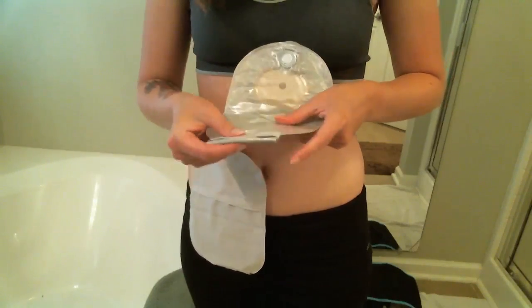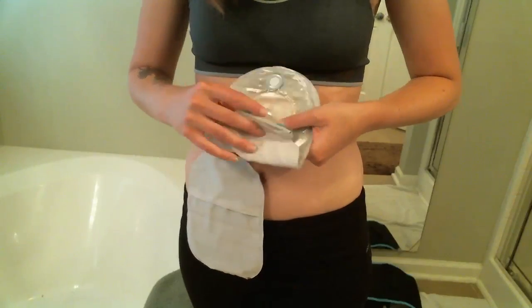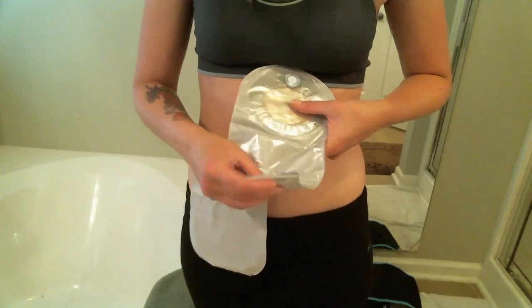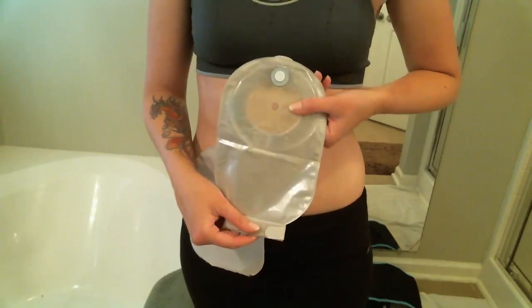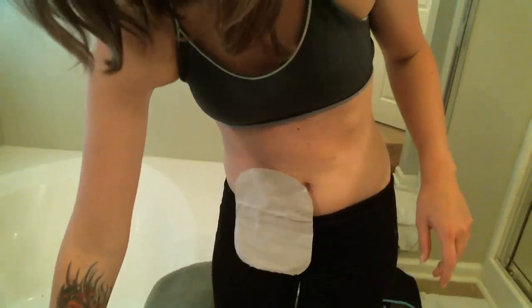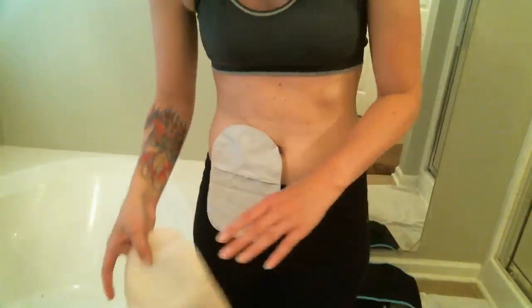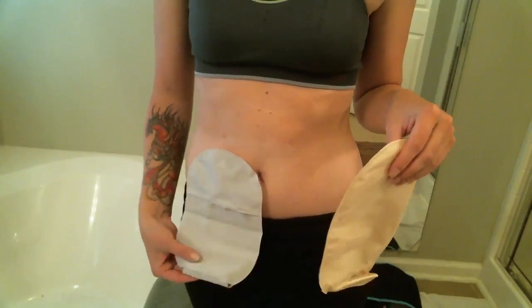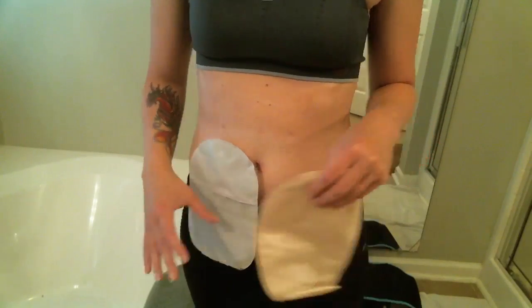The one difference with the clear bags is that it does not have that extra hold up piece that you can hold it up here, but it has the same one down here, for some people who prefer a transparent bag. I am not one of those people. But yes, as you can see, it's fairly similar in a lot of ways, but also has a lot of different features and upgrades.